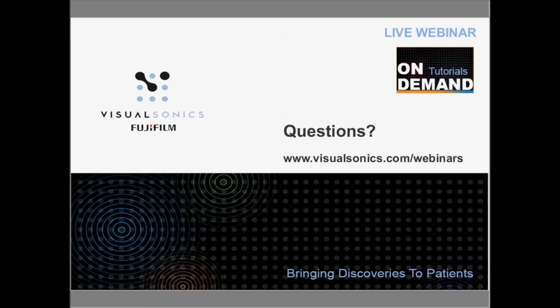So I would say work with it and try different gels. There's a wide range of viscosities of gels that are available, and depending on how often you image, like if you only image for a week and then everything sits for 2 weeks or 4 weeks or whatever, if you're on a time course, as that gel sits, air bubbles can form in the gel. So it's not a bad idea to maybe try spinning your gel down and try to get rid of some of those artifacts.